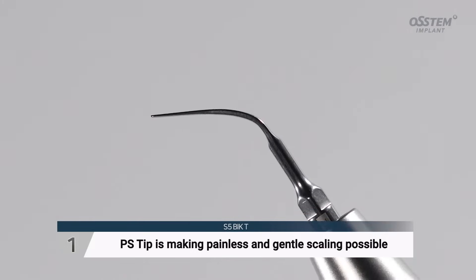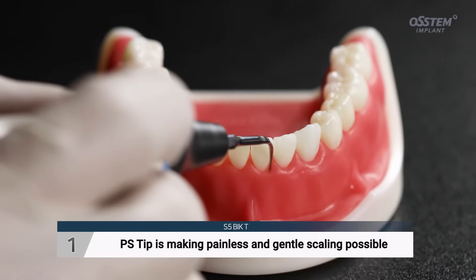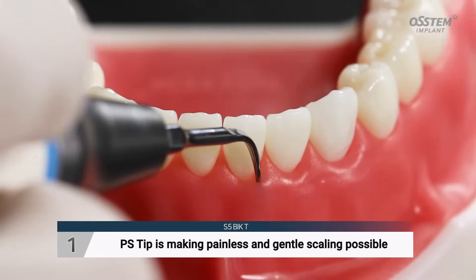The PS-tip is especially long and thin, making painless and gentle scaling possible.